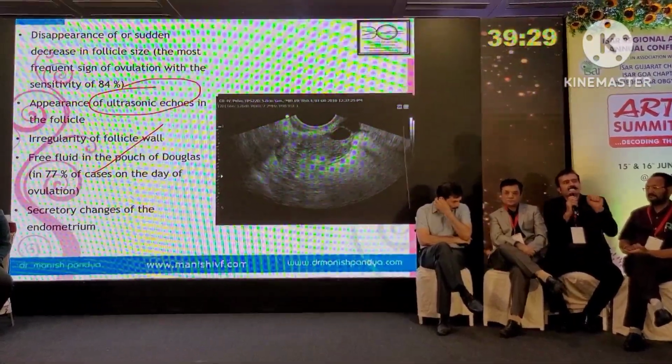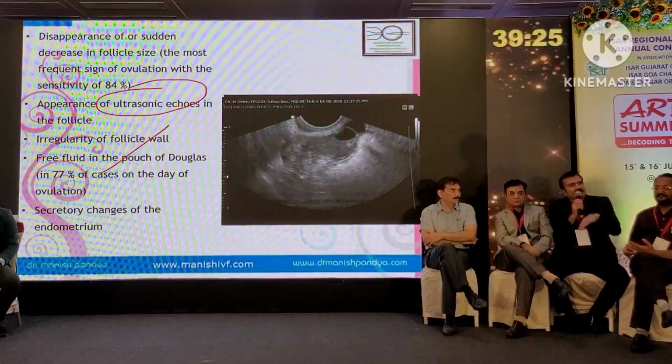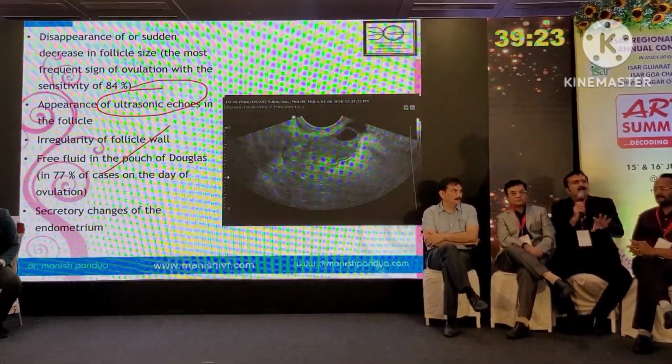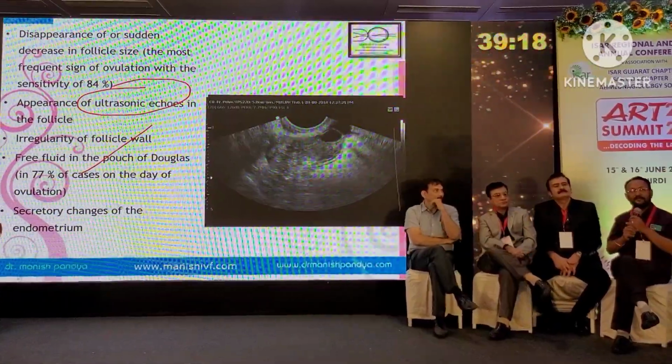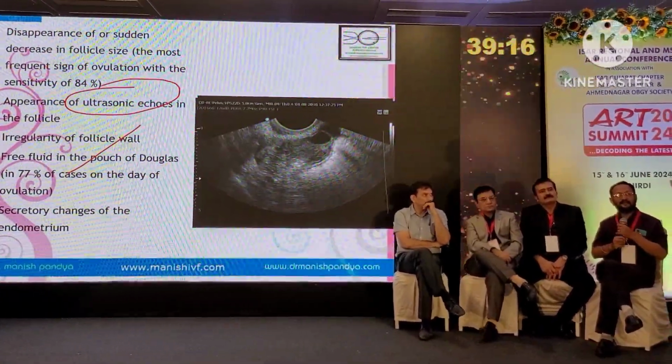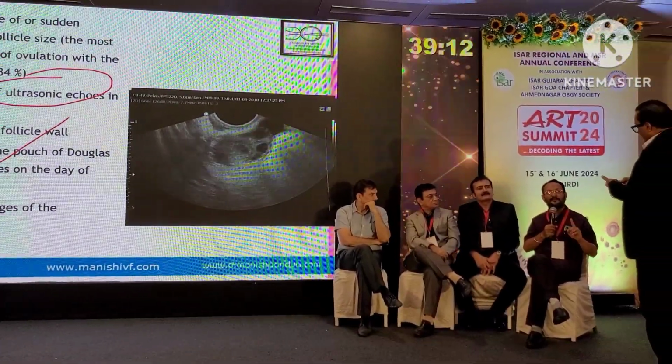In many infertile patients, the first time we see them in the mid-cycle or secretory phase, we can say the patient is ovulating. So progestinization of the endometrium, the triple line goes, a very good ground glass appearance. We can call it the pregnancy conducive endometrium. Above all these things, patients will complain of pelvic pain and a little discharge because of the ovulation.